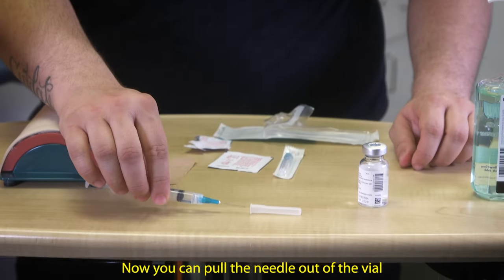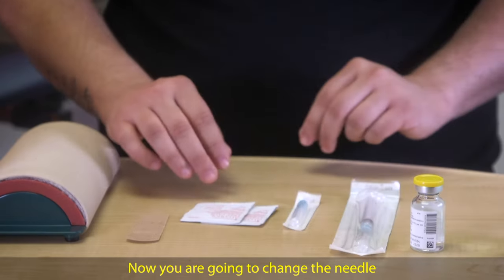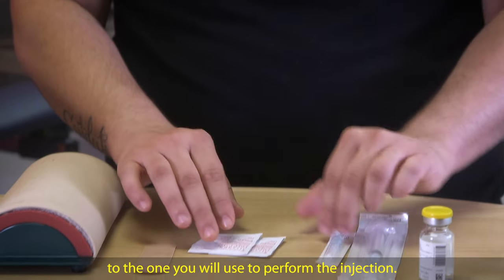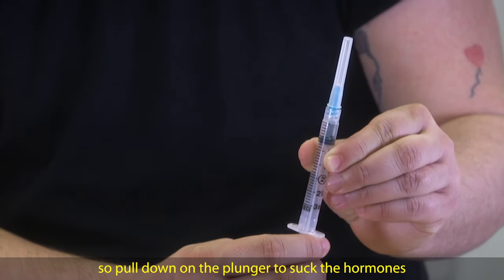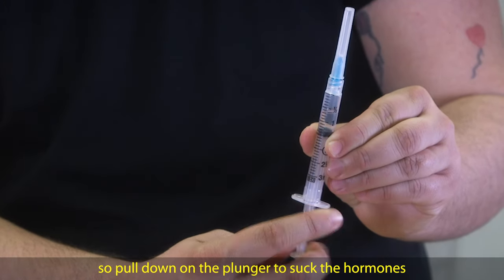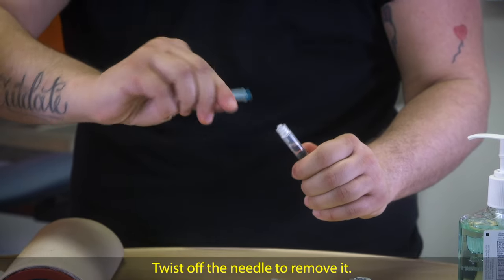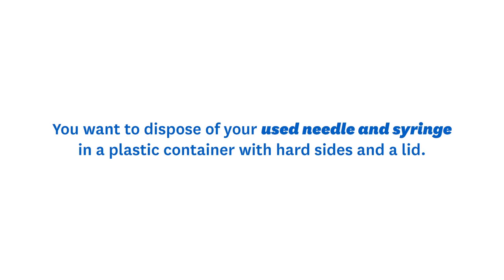Now you can pull the needle out of the vial and very carefully recap the needle. You are going to change the needle to the one you will use to perform the injection. There are still hormones inside of the needle, so pull down on the plunger to suck the hormones from the needle into the barrel of the syringe. Twist off the needle to remove it. You then want to dispose of your used needle and syringe in a plastic container with hard sides and a lid.